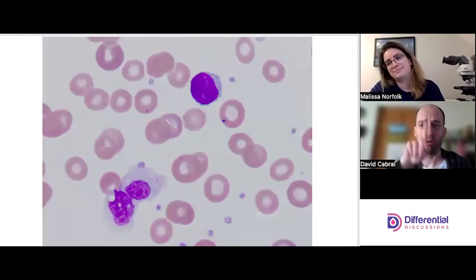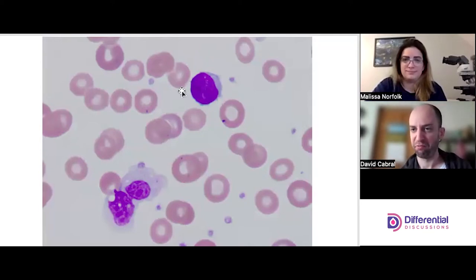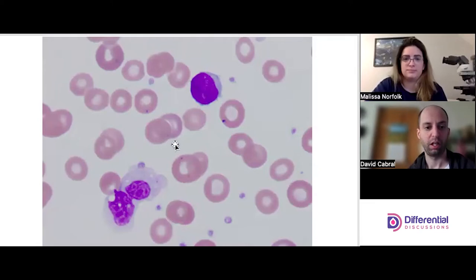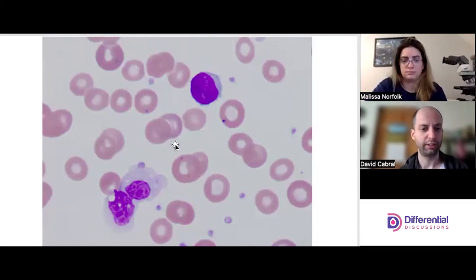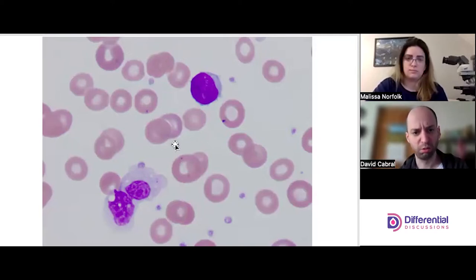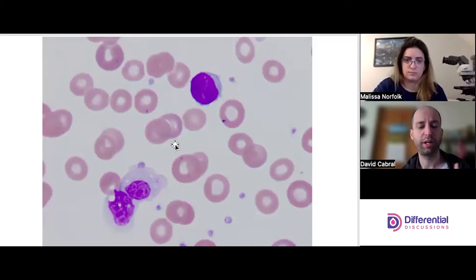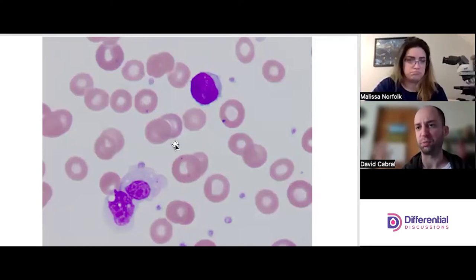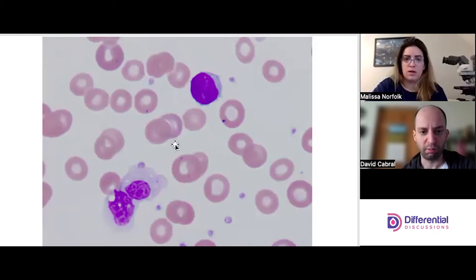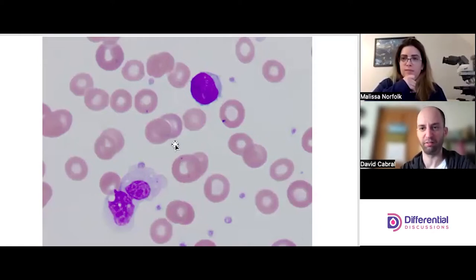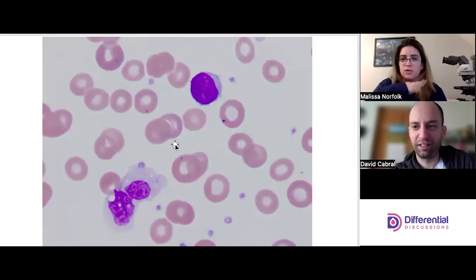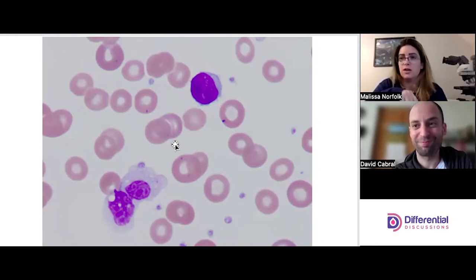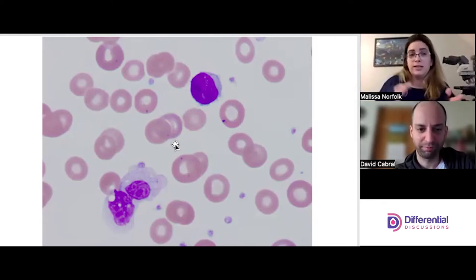We're not going to focus on the upper cell — that looks just like a small round resting lymph. But looking at the bottom left: I see a prominent vacuole, a lobed nucleus with multiple lobes, cytoplasm with a blue-gray character, and it's interacting with a red cell. This one's sending me signals. The segmenting is interesting — monos don't always segment, and students can easily confuse a segmented mono with neutrophils.